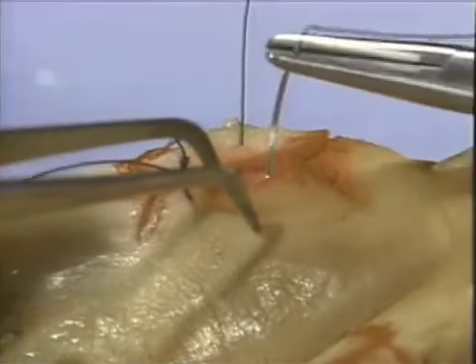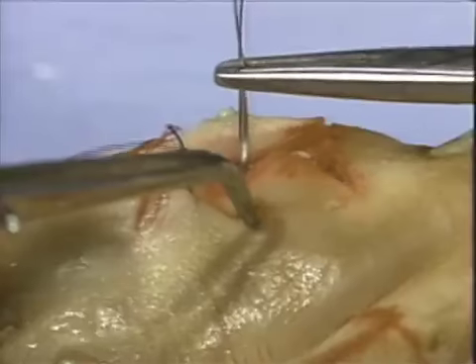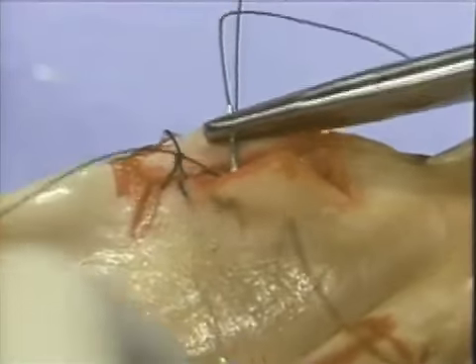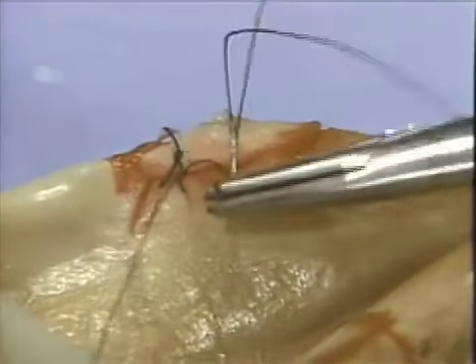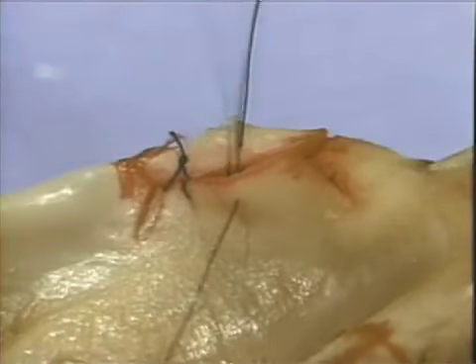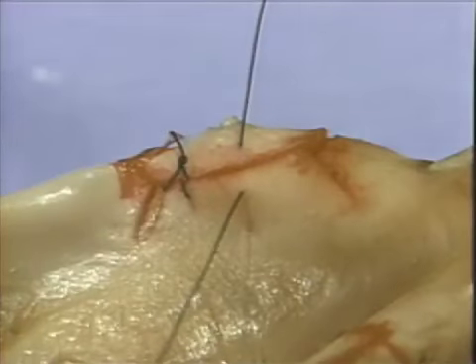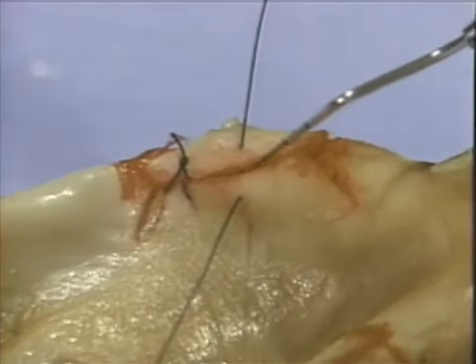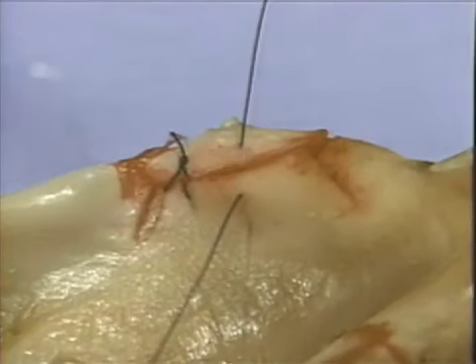In the lingual flap, the suture needle is advanced from the tissue side of the flap through the gingival tissue to the oral surface. While the suture passes from buccal to lingual, it does not pass through the incision itself, but underneath it.